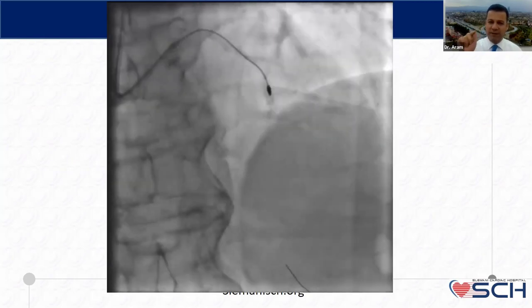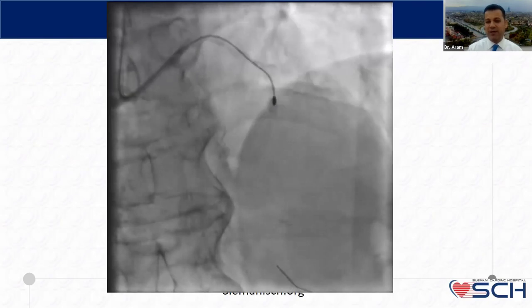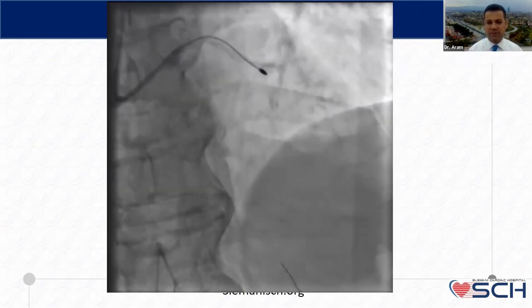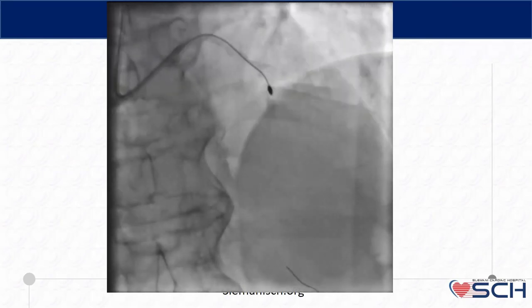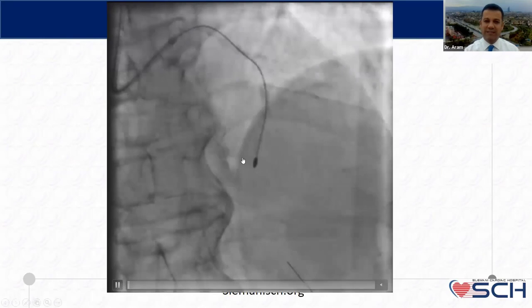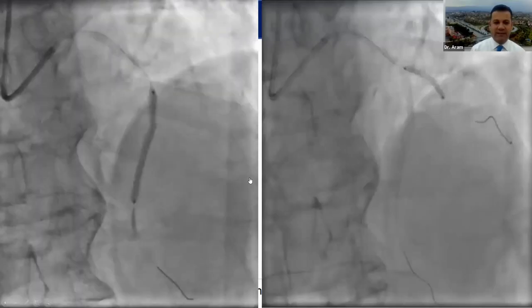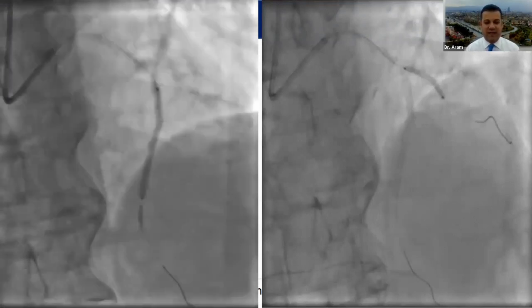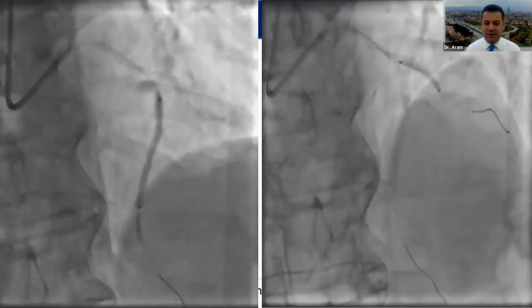No, you should have a pecking motion, especially in the beginning when you are going to crack or do atherectomy for the proximal part. And all the time you should go behind the calcified spot. If you look here, we have calcification till the mid part of the artery, and just after that, it is a very nice feeling that after that you think that any balloon cannot cross.